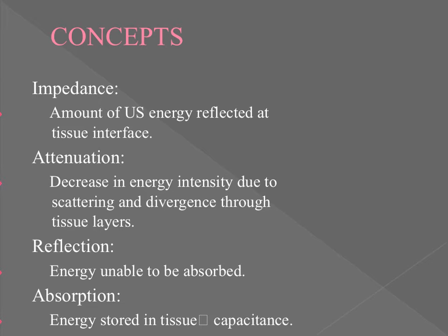In other words, as we move from tissue layer to tissue layer, that energy is going to be absorbed, it's going to get scattered, it's going to diverge. And so that process of attenuation is this process of decreasing in ultrasonic energy as we progress from one tissue layer to another. We're going to come back to this concept of attenuation in just a second. But essentially, it represents the amount of energy left over as we move from one layer to another.